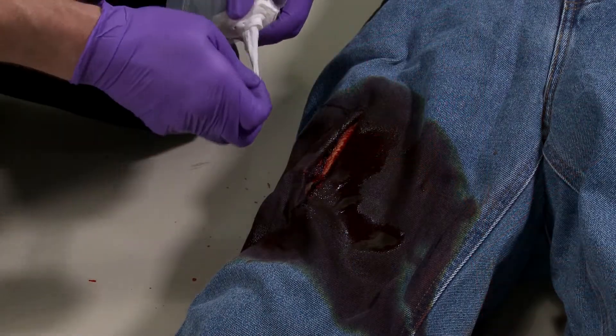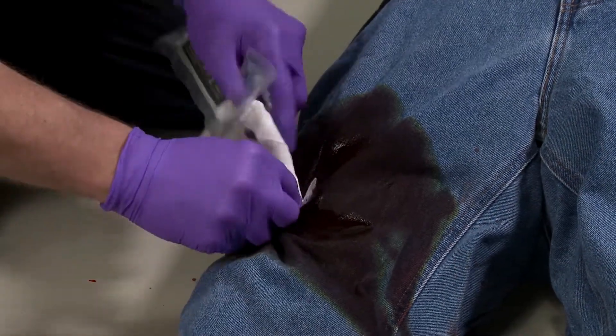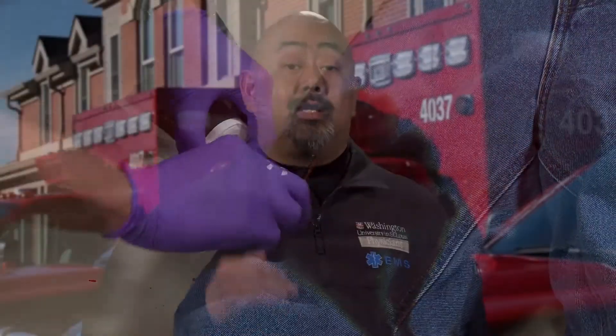Packing a wound is just what it sounds like. The most effective way of controlling bleeding is with your finger, but sometimes we have to apply additional material to maintain pressure on the bleeding vessel. This can be accomplished in a simple five-step approach.